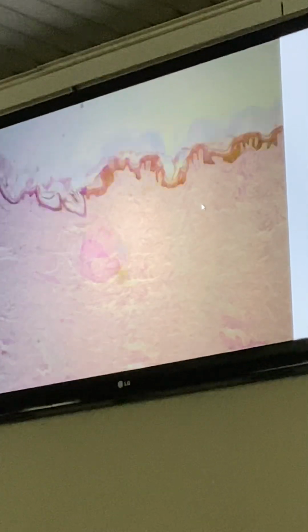Let's start with the first part of the, sorry. Section in Negro, black people, you can see the melanocytes with the melanin pigment responsible for giving the dark color. So, sorry, the last slide is the skin section in Negro.